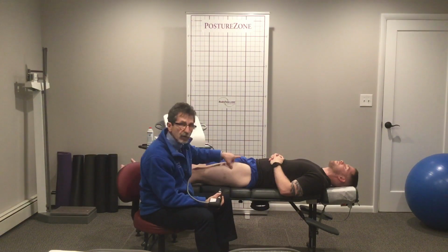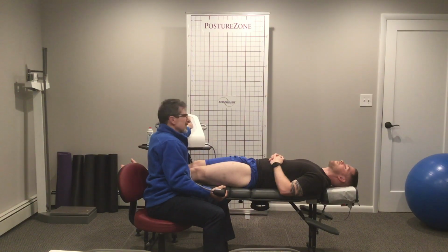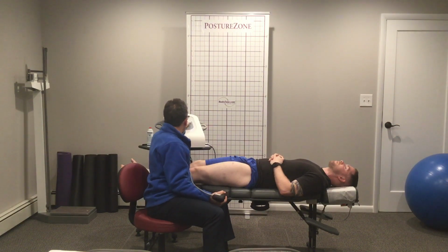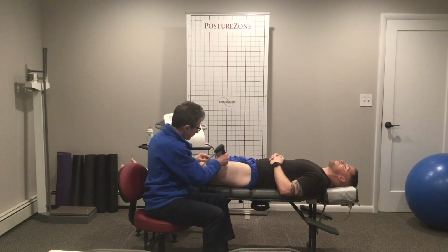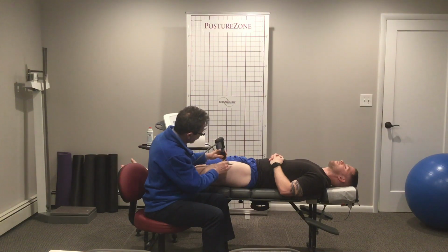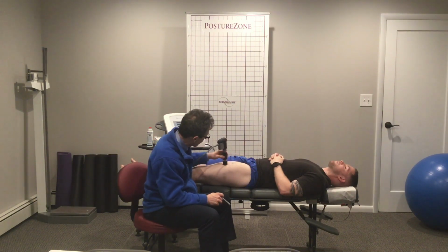So let's say this is more of a chronic situation. It's been around for a while, and it's tight, and it's stiff, he's having problems driving through when he's running, there's a pretty thick muscle. I'm going to crank this up to about 2 bar, and I'm going to drop it down to about 15 hertz. So a little slower. And you can even, I don't know if you can see it, but that marker's really dropping. And I can go right over it.